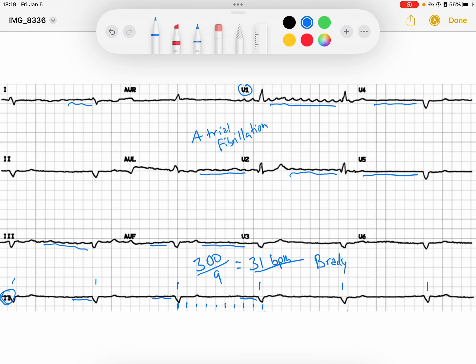These fibrillatory waves are not perfectly organized. You might ask: how are you going to call this atrial fibrillation? I thought atrial fibrillation needed to be irregularly irregular. So let's take a look at why we can still have atrial fibrillation with a regular rhythm. This QRS is wide — the QRS duration is greater than 120 milliseconds. So this is a wide QRS.